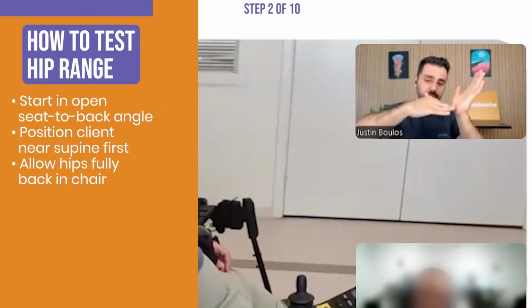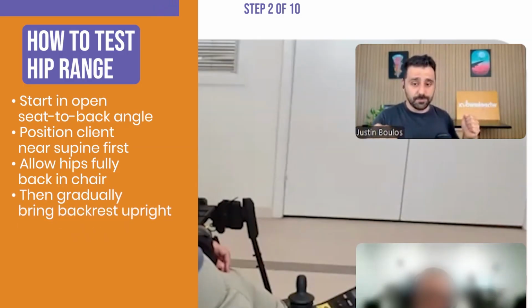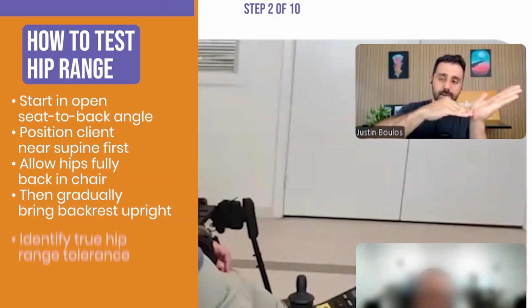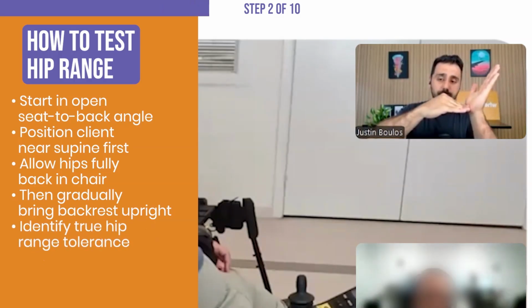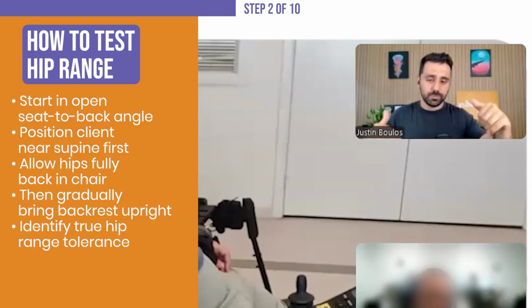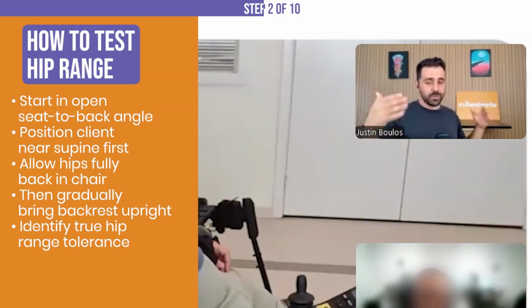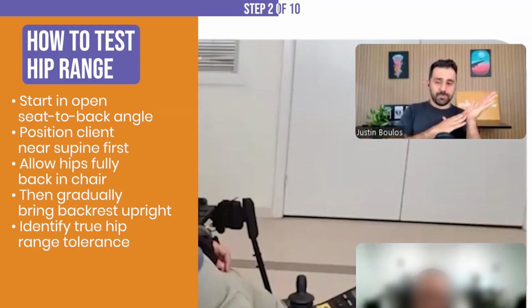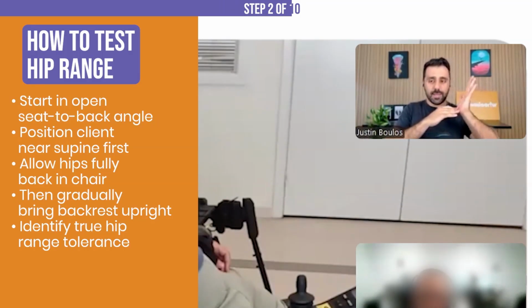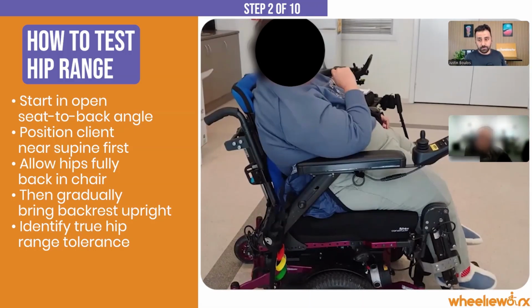And then once we open up the chair, it allows us to get her hips back because the seat depth's not getting in the way. Then we can start to explore, all right, how much can we bring the backrest up before we start either causing pain or losing her positioning. Yep. So essentially, I reckon you would be able to fit her in a 22-inch wide by 16, but you'd need to open it up first, and then you need to find that angle as to where she starts losing it. Yep. And then we can fix the backrest at that angle, essentially, is what we want to do.